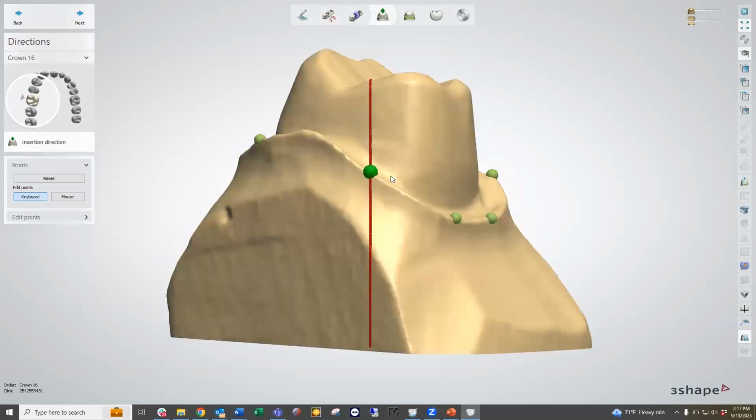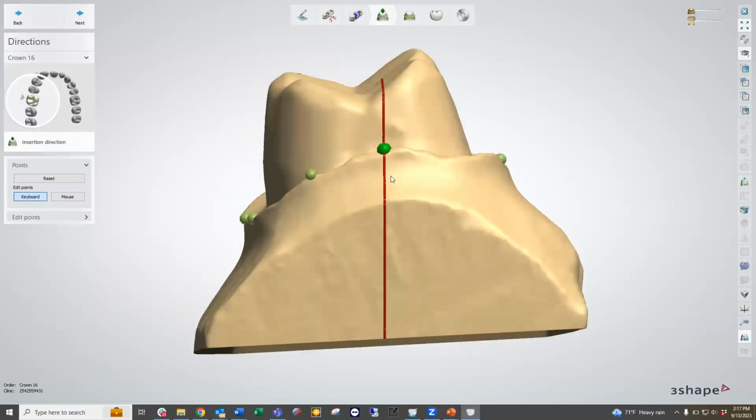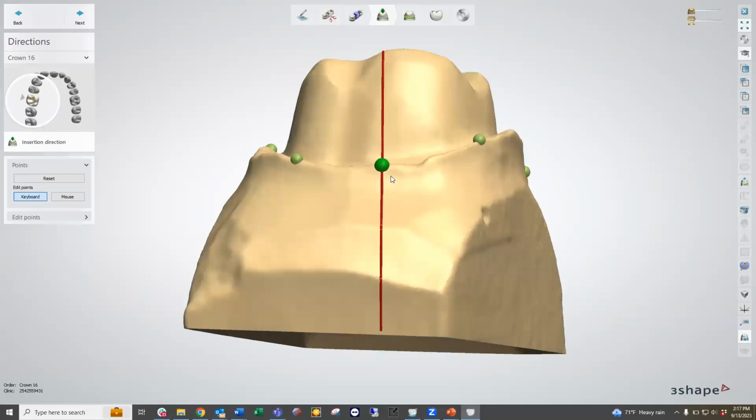So I'm going to go ahead and put this right on that marginal ridge that we see here. And I'm just going to grab the height of contour on that ridge just to make sure that green dot is encompassing that area, and move along and survey those individual dots and see that they're sitting on the relatively right points.